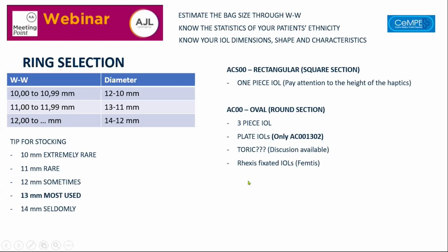And while the capsular bag shrinks, the stress on the zonule grows. So it's not a surprise that maybe some time after surgery, you find a zonular problem because the shrinking of the capsular bag produces zonular stretching.